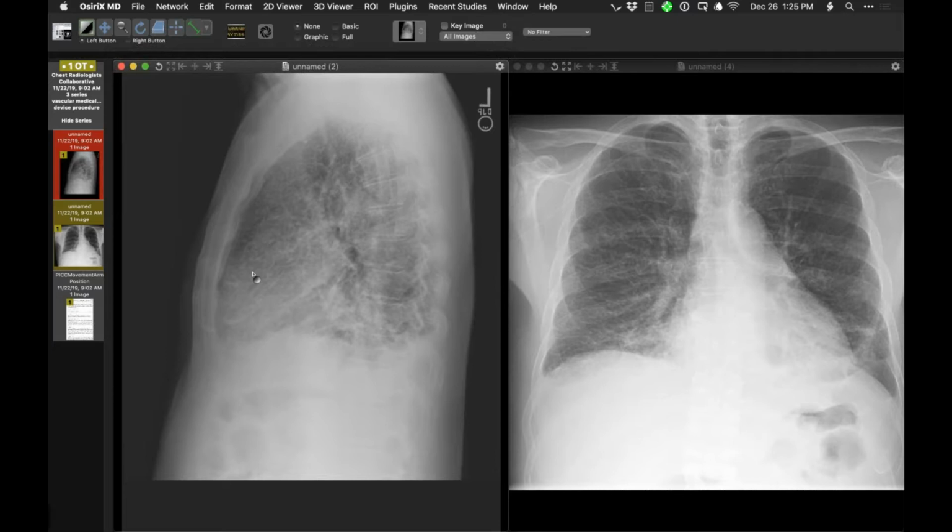Yeah, so that brings up a question. My fellow and I were discussing this morning because she asked the question, like, do we call every time a PIC has flipped, from a daily radiograph to the next one? And I used to. I admittedly now don't on just daily radiographs. And Jeff, I know you're not doing many daily ICU radiographs anymore, but because it's so common for them to just flip back down, I don't consider it really an emergent finding.